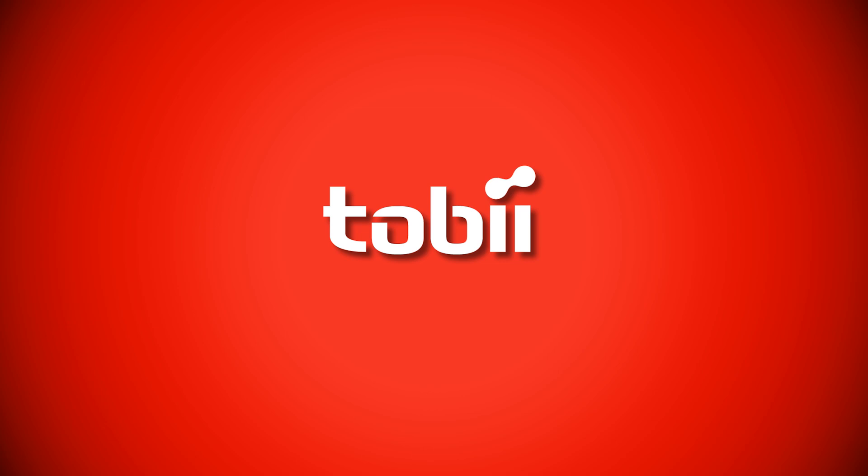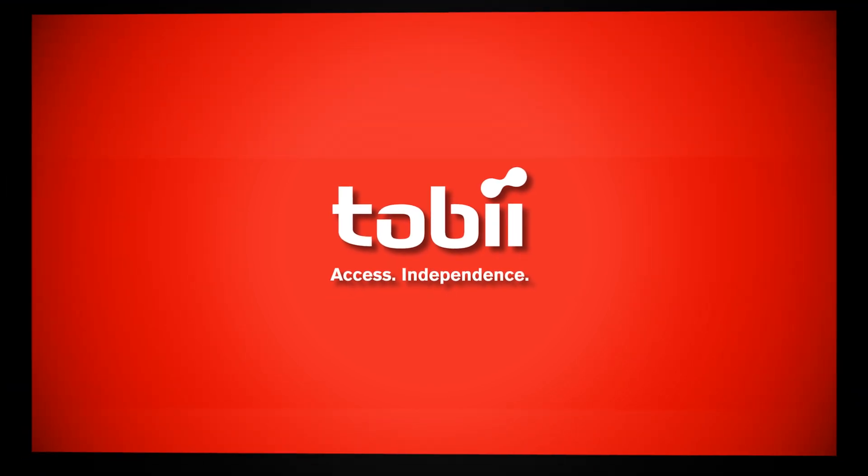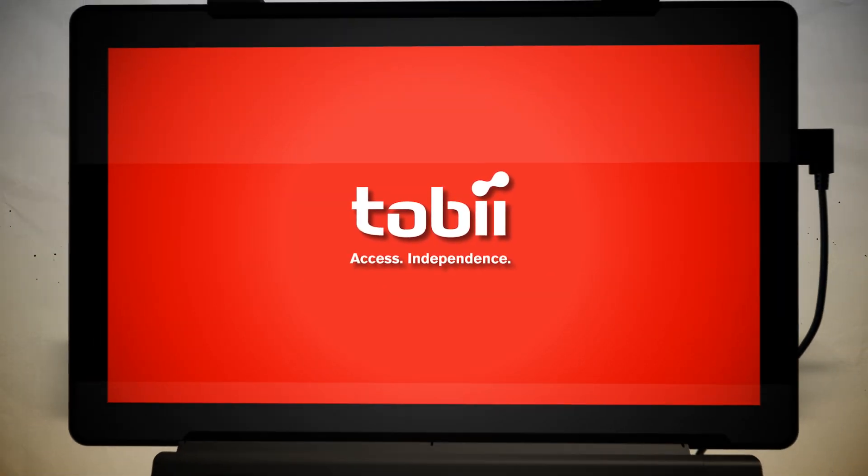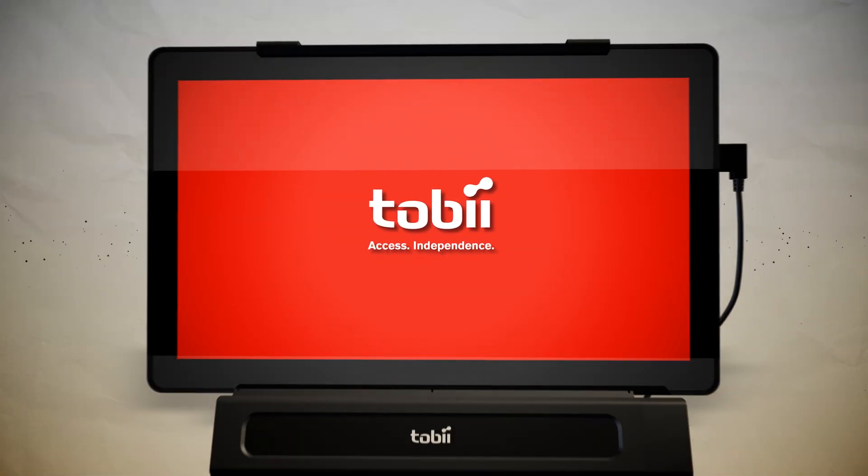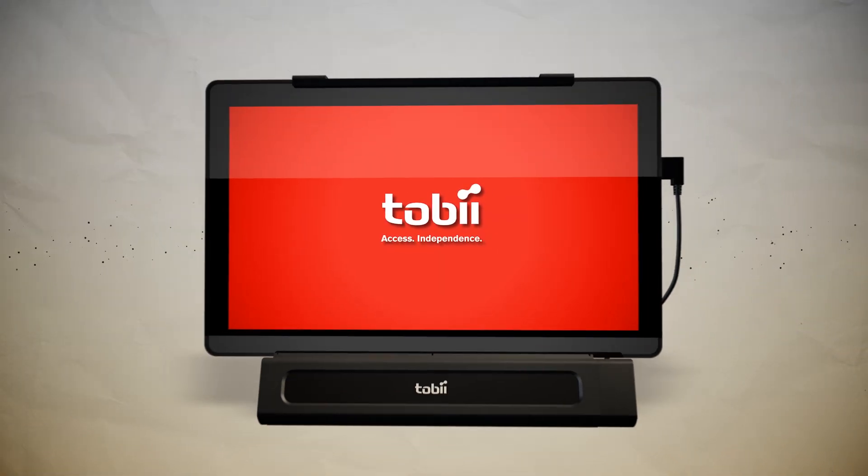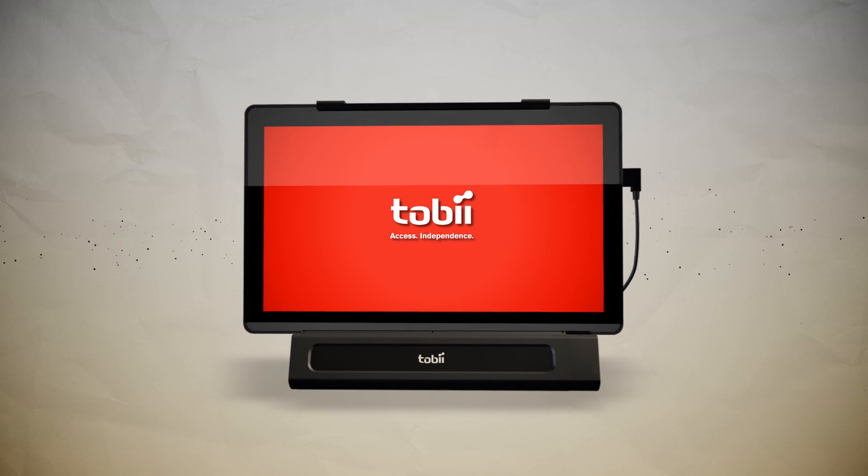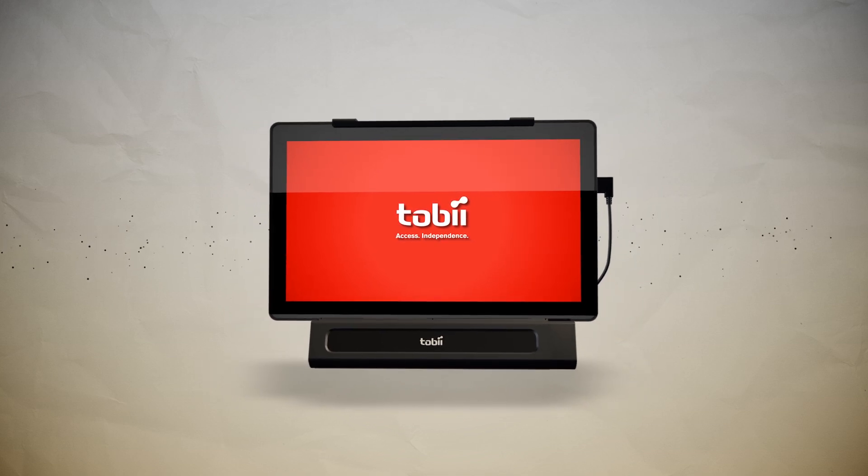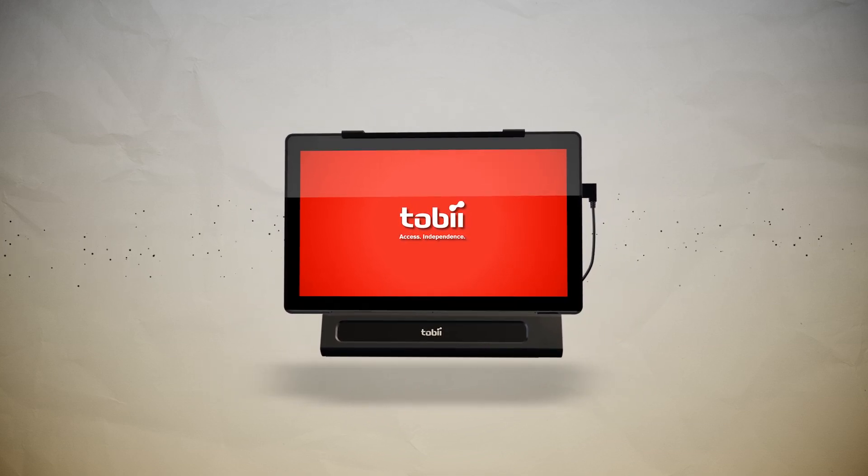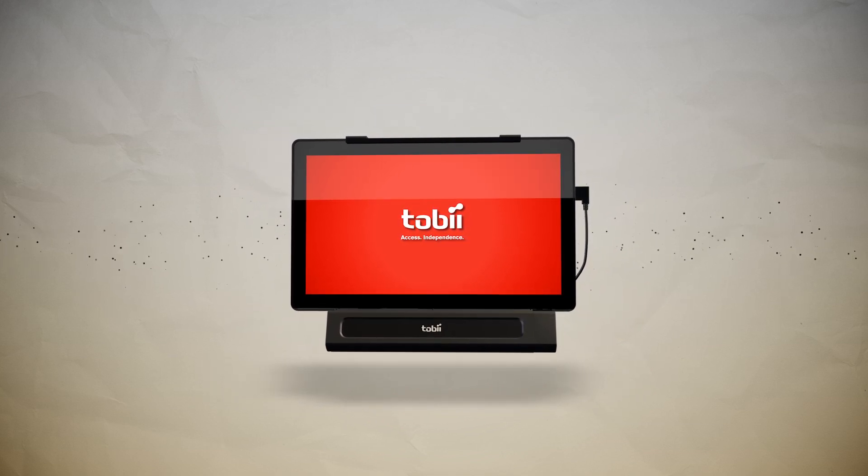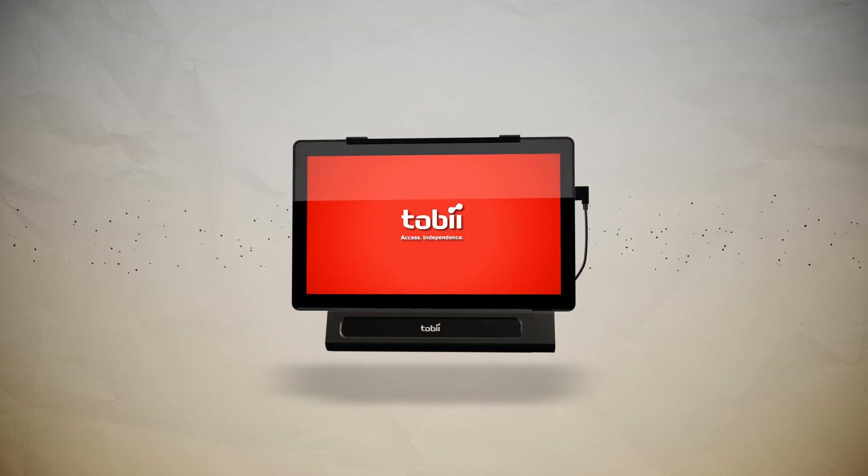Tobii Access Independence. The Tobii iMobile brings fully functioning gaze interaction to standard, off-the-shelf Windows 8 Pro tablets.